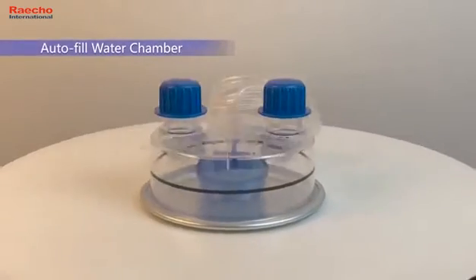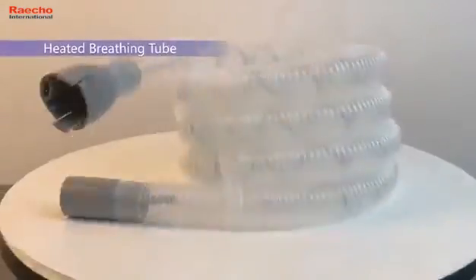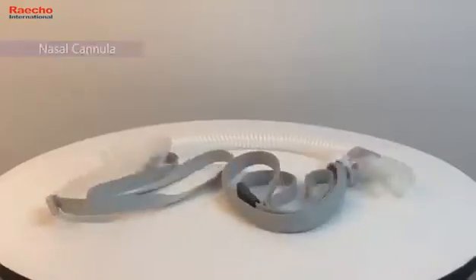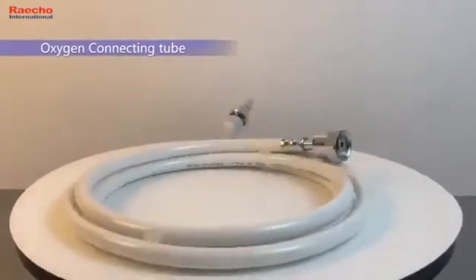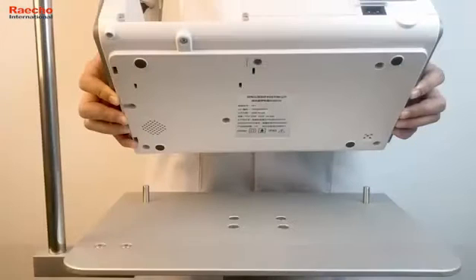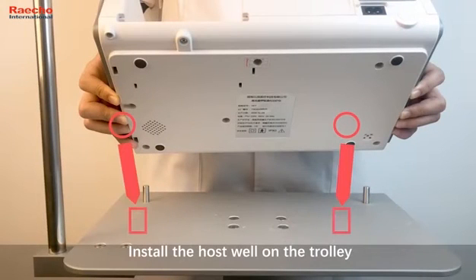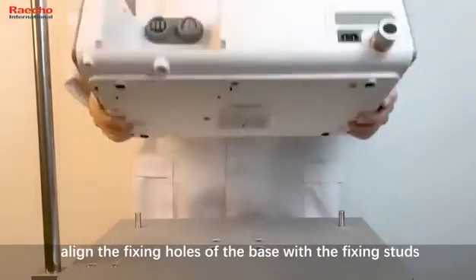Accessories. Installation. Install the hose wheel on the trolley. Align the fixing holes of the base with the fixing studs.